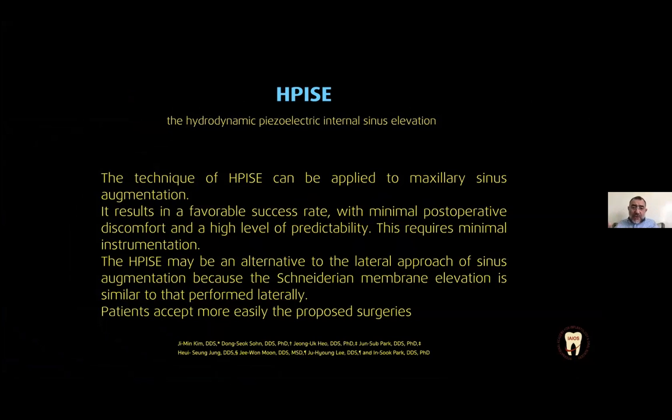It's called Hydrodynamic Piezoelectric Internal Sinus Elevation. This technique can be applied to maxillary sinus augmentation. It results in a favorable success rate with minimal postoperative discomfort and a high level of predictability. It requires minimal instrumentation. The HPISE technique may be an alternative to the lateral approach of sinus augmentation, because the Schneiderian membrane elevation is similar to that performed in the lateral approach.